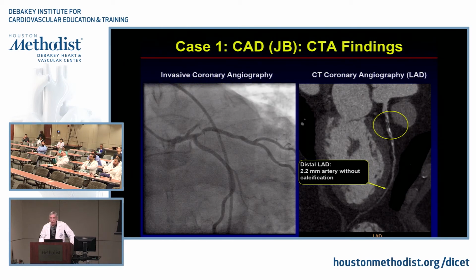Okay. Well, part of it is because remember this is an equilibrium study. So we've already gone through the venous phase of everything when we do these things. So you're already getting some collateral filling distally.